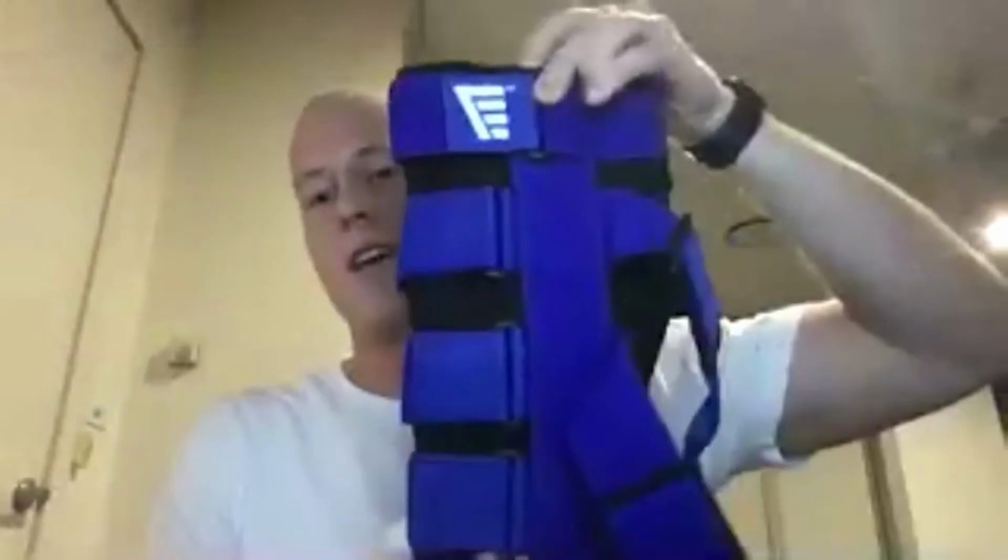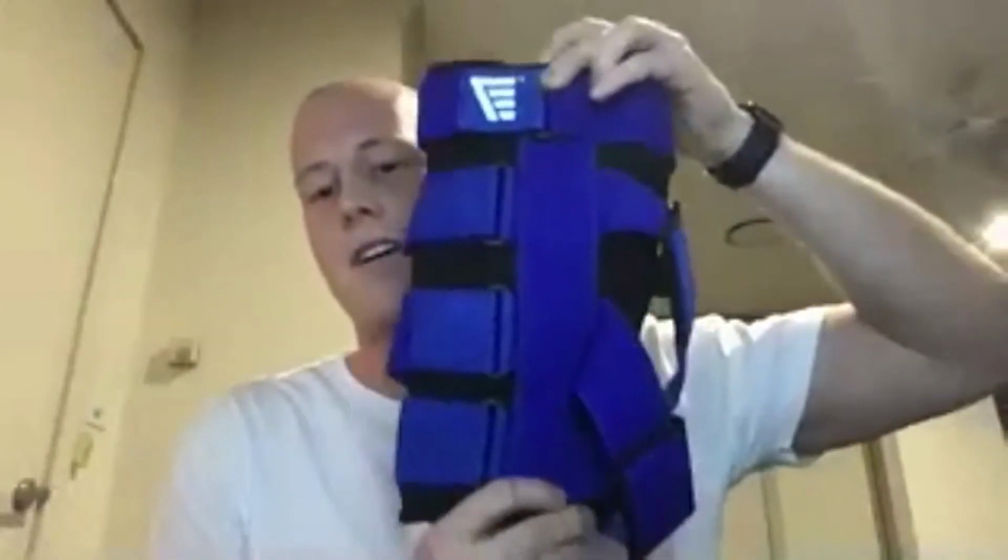And we're very early days at the moment. But the whole hypothesis of the device and the way it works, I've got a fresh one here. I don't know how well we can show it on the camera. So nice and blue, so it sticks out like a sore thumb on a leg. But the mode of action: compress the periostitis along the distal third of the posterior medial tibial border.